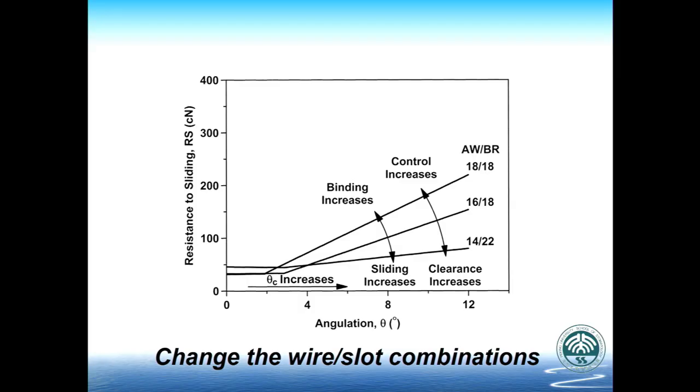The brackets, after you bond them, are fixed. So you can just adjust the size of the archwire to balance the control or balance the movement.